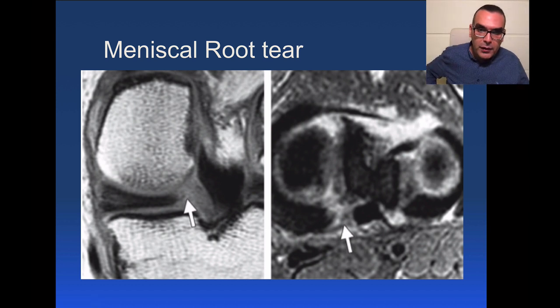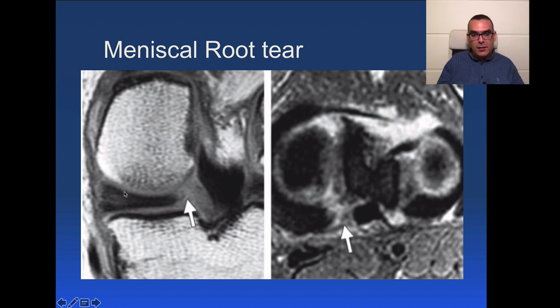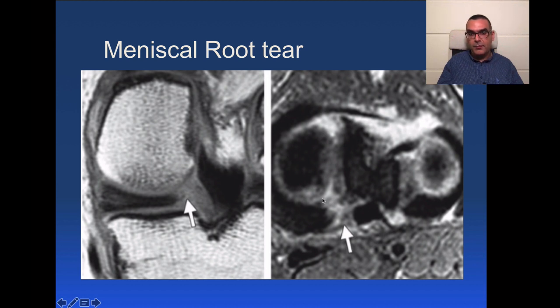An important variant is the meniscal root tear. The meniscal root must always pass the edge of the condyle; when you don't see it, this is a meniscal root tear. It is essentially a radial tear. The coronal scan demonstrates the root tear, and the corresponding axial scan shows a radial defect — the defect is perpendicular to the long axis of the meniscus.